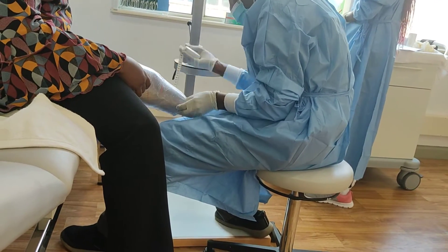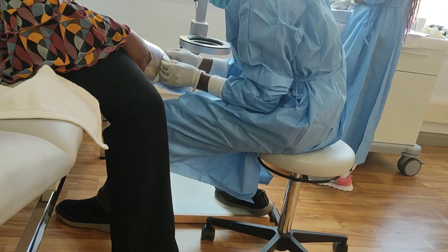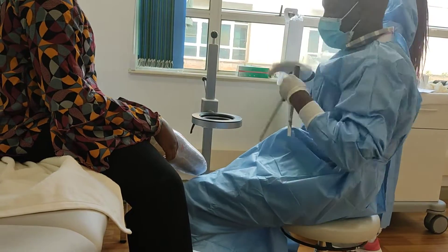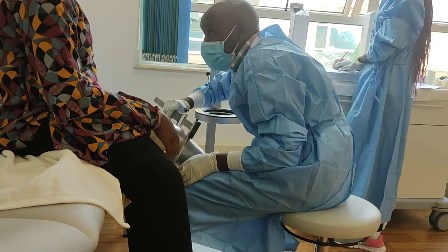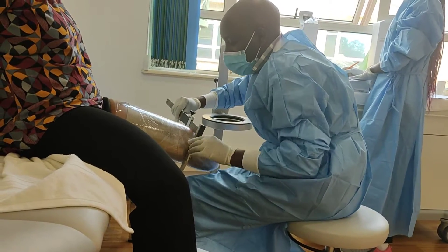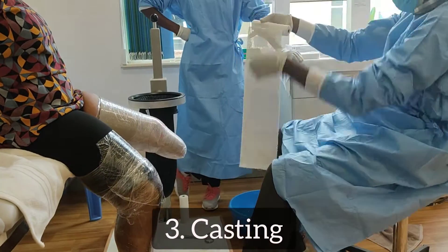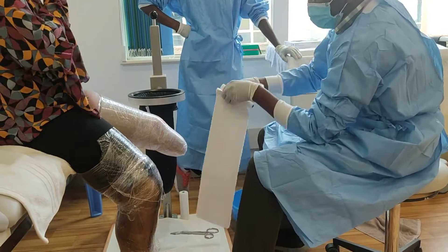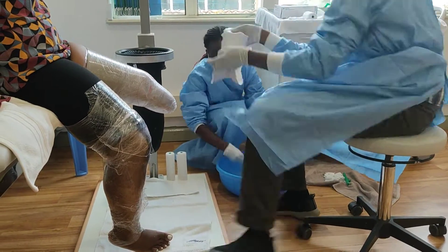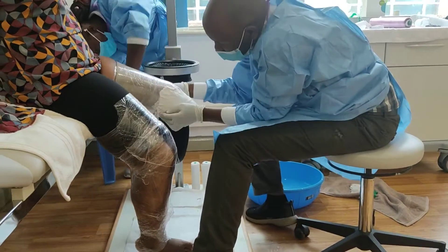There is a lot of measuring — measure, measure, measure, more measurement, then more measurement. The cast is made with POP, that's plaster of Paris. Once you dip it inside the water, it becomes very impressionable and it just molds to whatever you're trying to make a cast of, so as to get the perfect measurement.